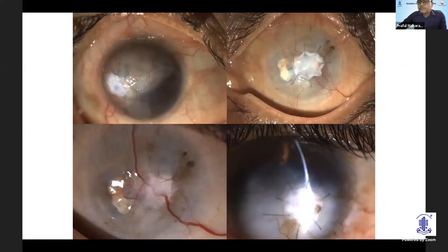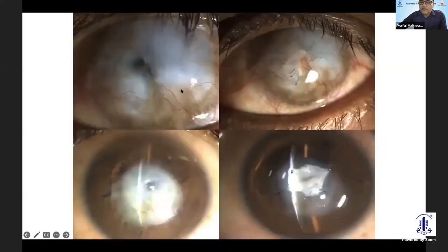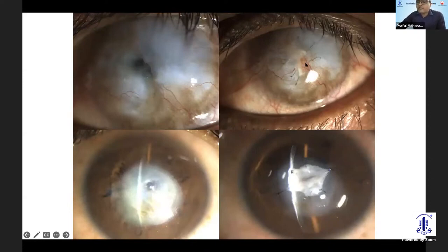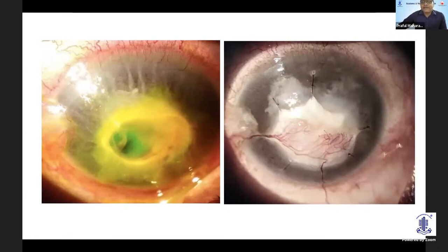Suture removal is a big problem because it's an acutely inflamed eye — you have to do a second procedure to remove all sutures, and yes, it induces vascularization. However, this was a larger neurotrophic ulcer and it healed quite nicely — you can see the tenon's tissue here. This is a picture sent by one of my fellows who had no access to patch graft or corneal tissue, so she did a tenon's patch in a large ulcer and it healed quite well.